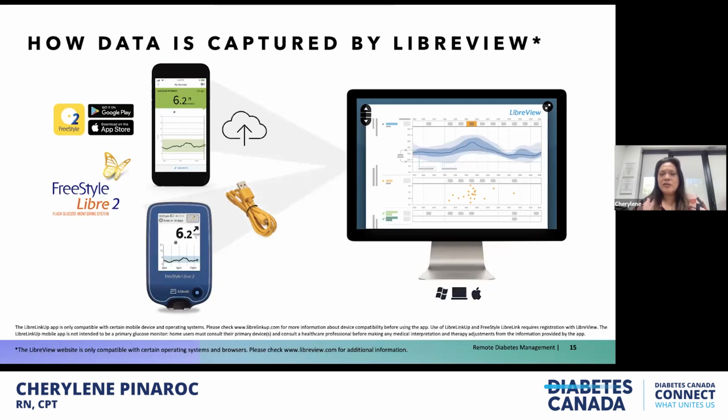So basically, the only difference is with the Freestyle Libre 2, you would have to connect your meter to your computer to actually get the data pushed and pulled from your meter to put into LibreView. On the telephones, it's already shared in the cloud once you actually create your profile. So that's one good way of using your phone. If you have the phones, it makes life a little more seamless in data capture and getting your blood sugars at the same time.